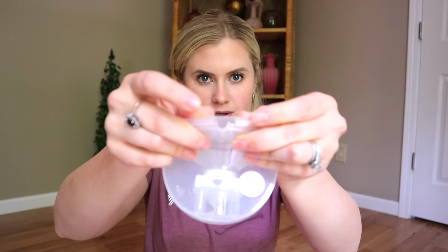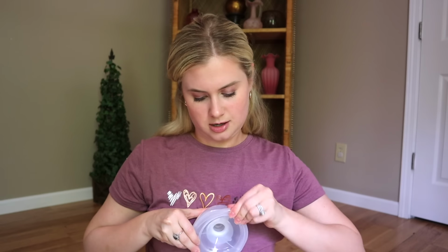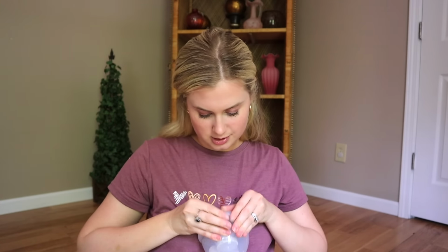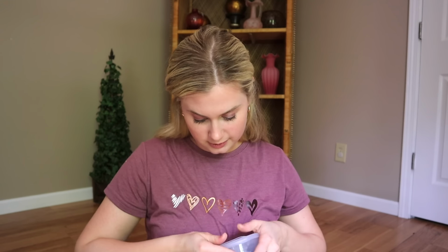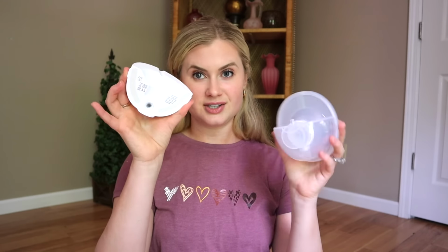And then up here, you want it to go on smoothly as well, so you see where there's a hole. And then I just go all around and make sure that the flange is on completely well, because, for example, if you don't put your flange on well and you try to pump with that going like that, you're gonna leak everywhere, and that would be extremely frustrating. So make sure you really fold over that flange so we don't have any leaking going on. And then you can just take your motor and it will pop right on.